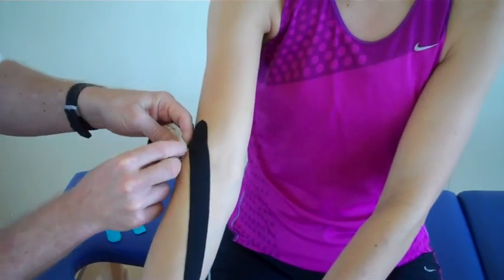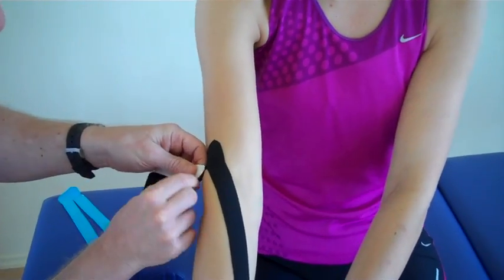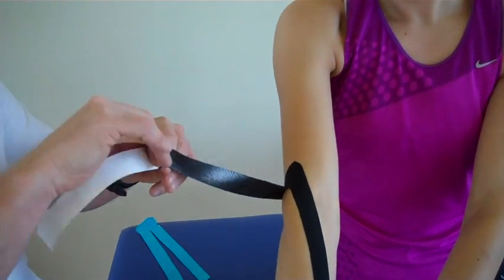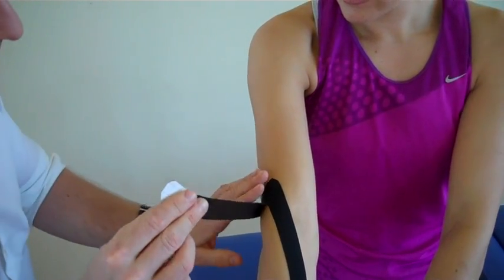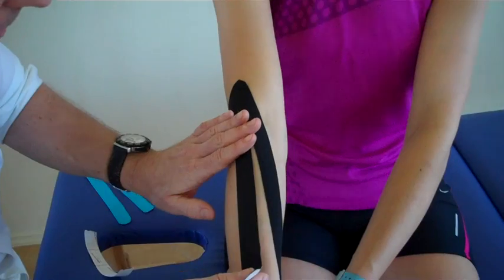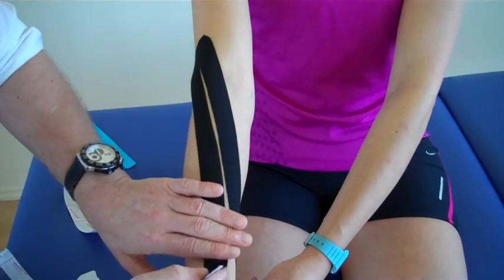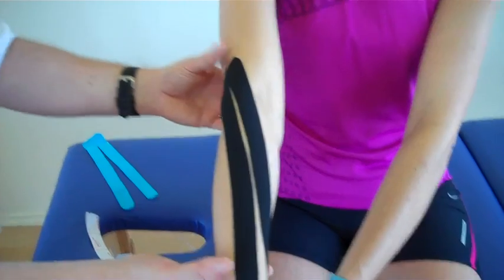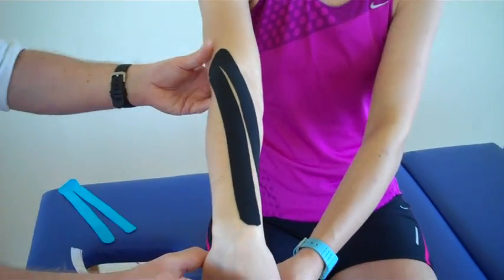Peel back the second leg — just catch that corner, peel it back, split the tape — and again, literally a little bit of tension but not much, come down like so. And from that position, that's the application of the first tape.